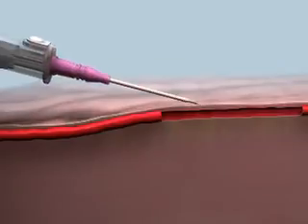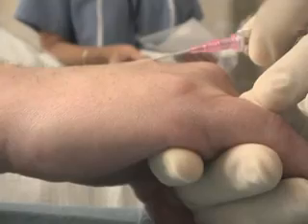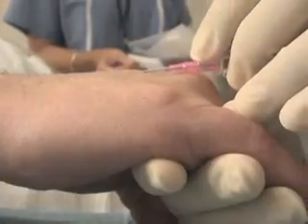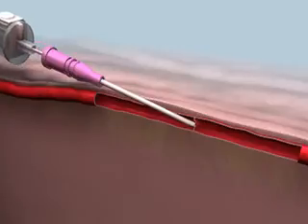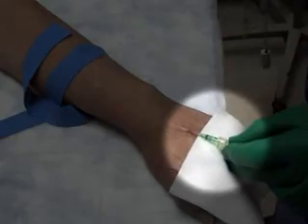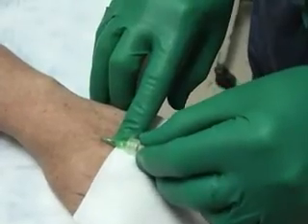These have been shown to improve the success rate of the procedure and to reduce the amount of time needed to perform it. Blood might flash back into the chamber if the tip of the needle has entered the lumen, but the cannula has not yet entered the vessel lumen itself. This problem can be avoided by reducing the angle of the catheter and advancing the needle a few more millimeters into the vein. A valve within the vein may prevent advancement of an inserted catheter. If this occurs, hold the cannula hub in place, remove the tourniquet, and connect the intravenous tubing to the cannula. Running fluid into the vein may open the valve and allow the cannula to be completely inserted.